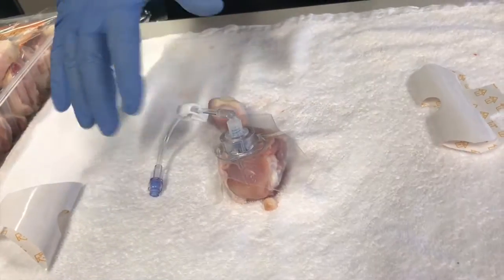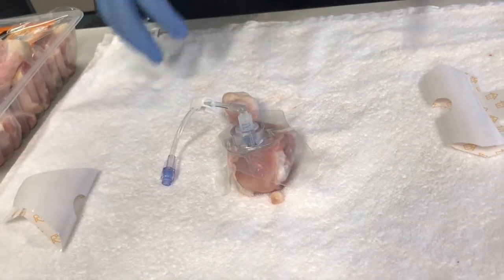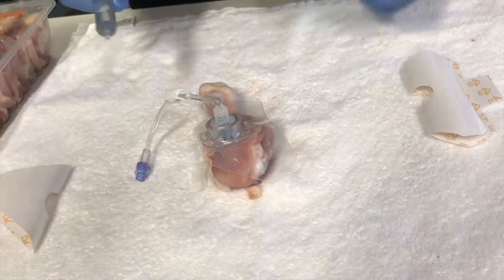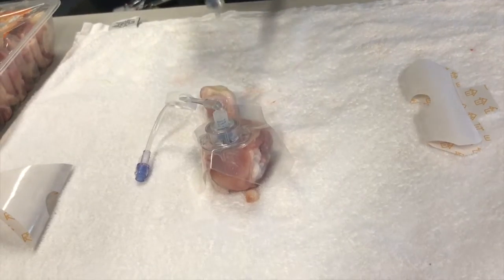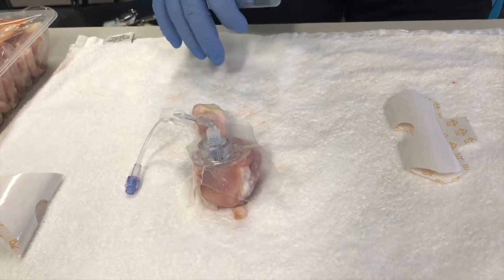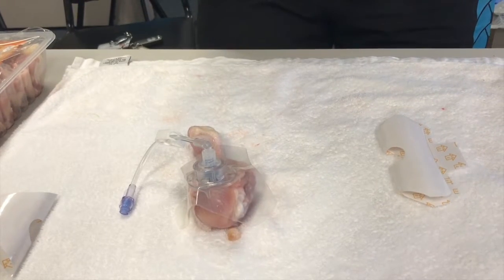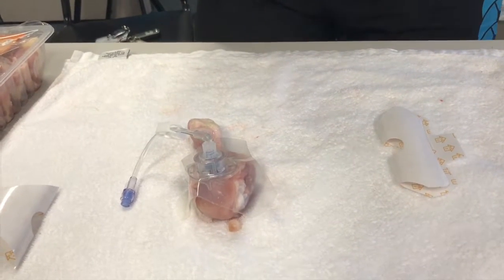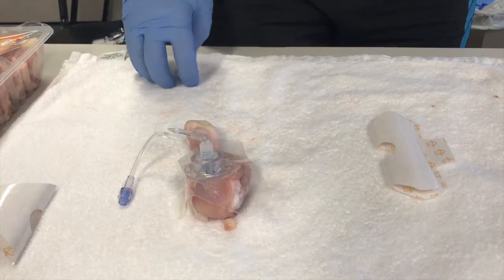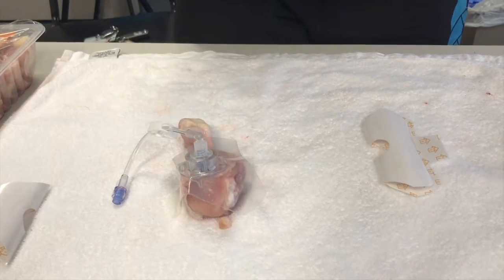Once I've placed my extension tubing, which I've already primed, depending on the patient that I'm putting the intraosseous needle into, if they are unconscious, I can simply just flush the line with 20 mL of normal saline or crystalloid for adults, or 5 to 10 mL for pediatrics. But if I've put my intraosseous needle in a conscious patient, I need to prime the extension tubing and flush lignocaine into it. I need to use 0.5 milligrams per kilo for adults and peds. For adults greater than 30 kilos, to a max of 40 milligrams, and for peds less than 30 kilos, to a max of 20 milligrams.